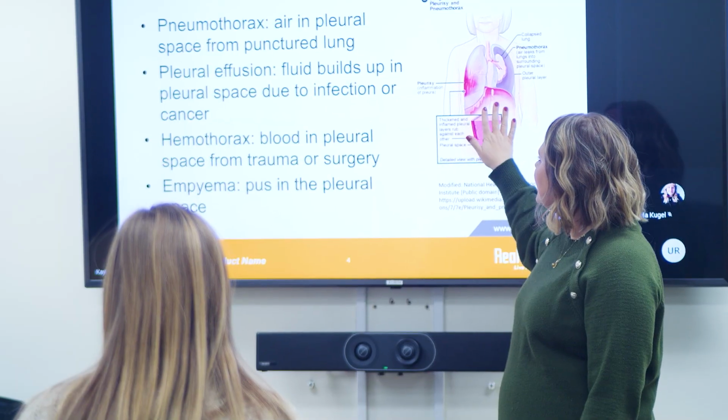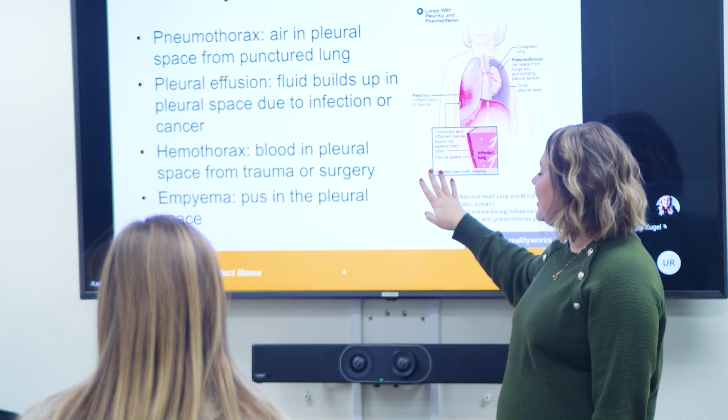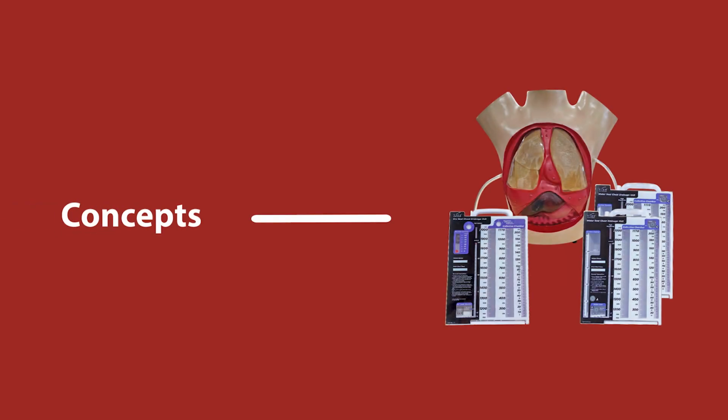Use Realityworks slides to walk through chest tube anatomy, system setup, differences between wet and dry suction, and how to troubleshoot common problems. Then connect concepts to the real device in the classroom, and prepare your learners to demonstrate understanding and application of knowledge in a simulation-based exercise.